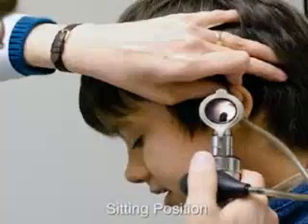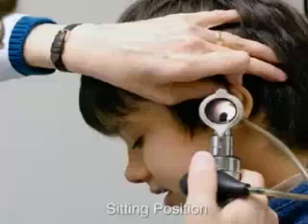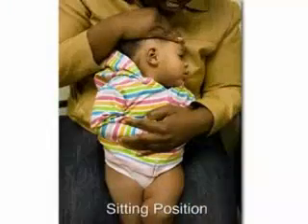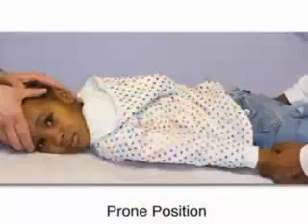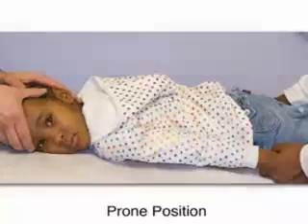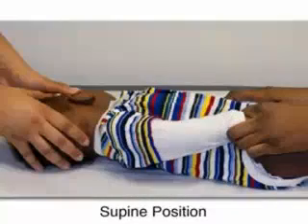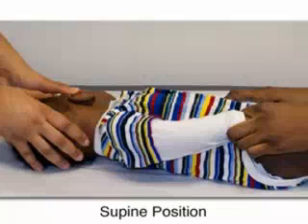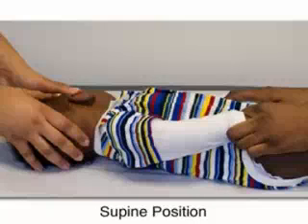Older children and cooperative younger children may be examined in the sitting position, either in their parent's lap or on the examination table. Uncooperative children are best examined while recumbent in either prone or supine position. The head should be firmly immobilized by an assistant. A second assistant, usually the parent, braces the child's body against the examination table. Depending on the child's position, one of the assistants must also firmly hold the child's hands.